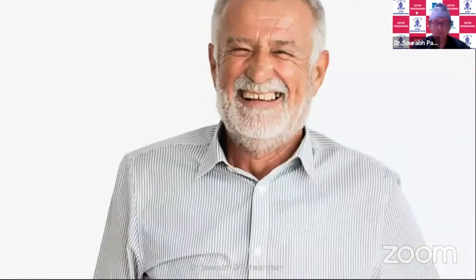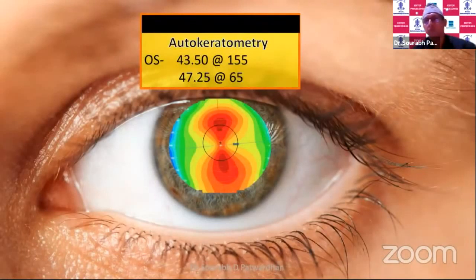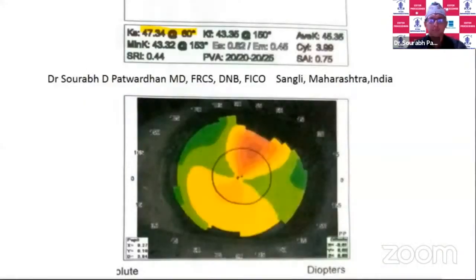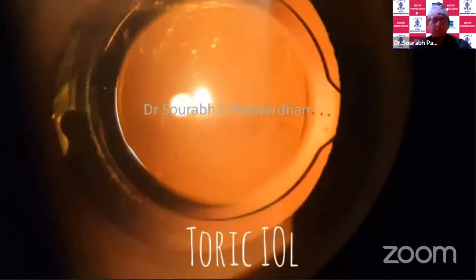When we get a patient with keratometry like this, where there is a cylinder of 4 diopters, obviously any ophthalmologist is geared up to do a nice toric IOL so as to give perfect vision to the patient. So you start reassuring the patient about great vision in the post-operative period, and you go ahead with the toric IOL surgery.